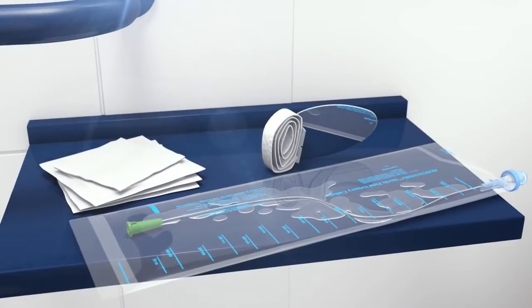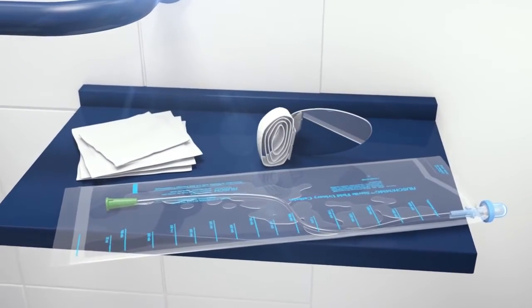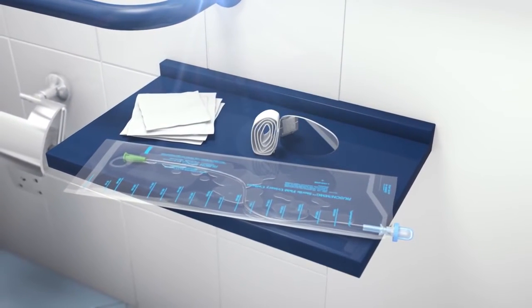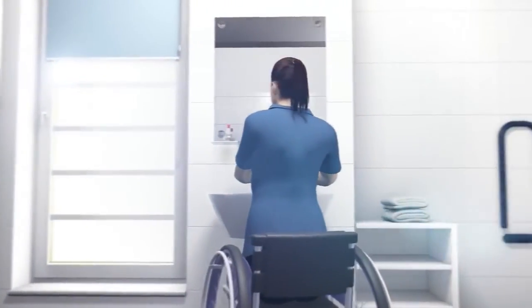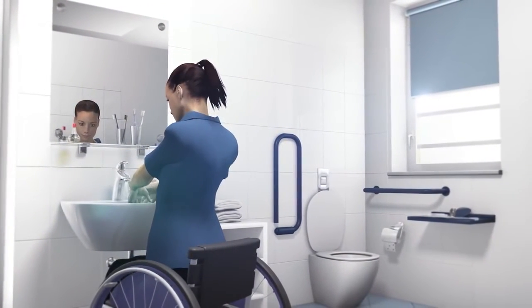For catheterization, you will need an MMG closed system, an antiseptic for cleansing the urethral opening or meatus, and an optional mirror for helping to visualize and locate the meatus. After gathering all the supplies needed, wash your hands thoroughly before performing your catheterization. Having clean hands is one of the best ways to help reduce the risk of infection.